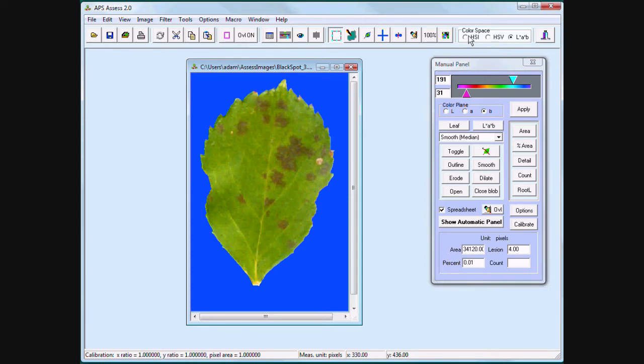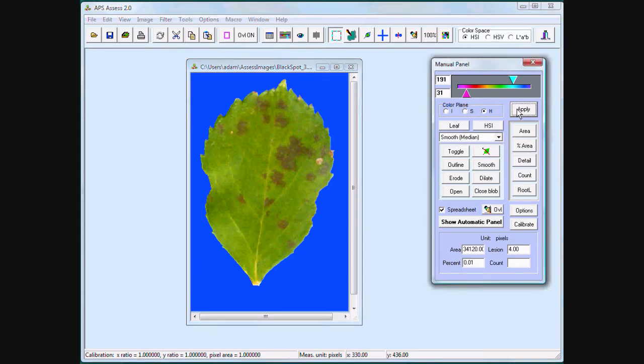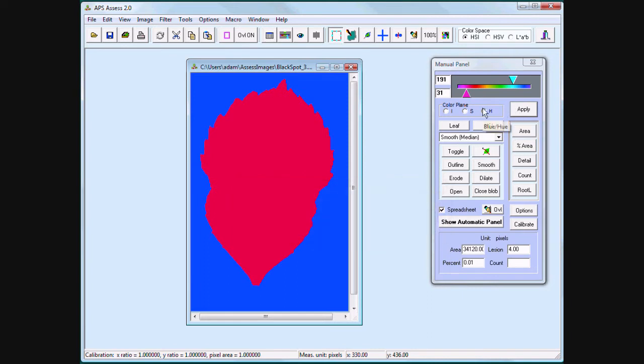Change to the HSI color space. Threshold the leaf.